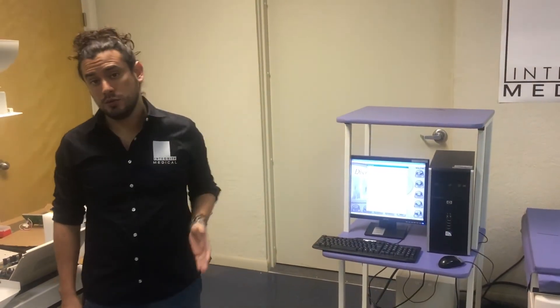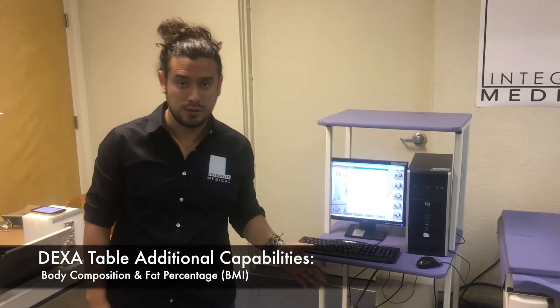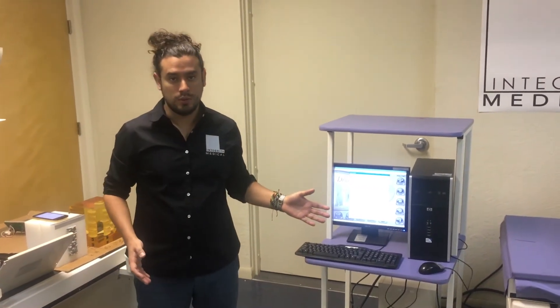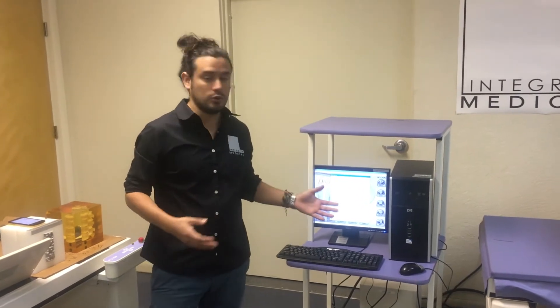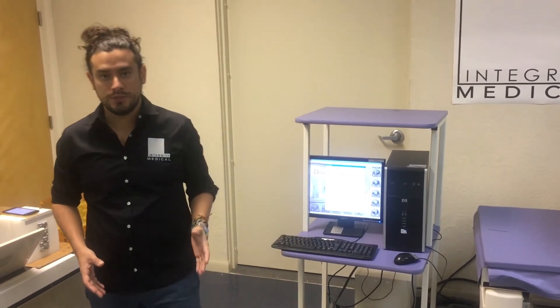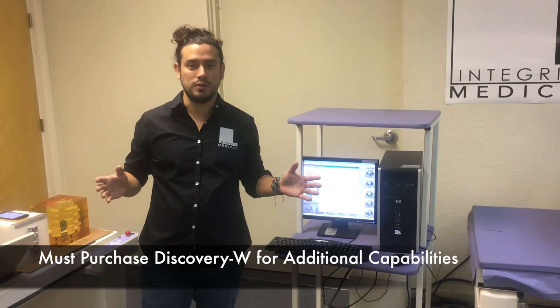A DEXA table can do more than just bone mineral density or fractures. You can also get body composition and fat percentage. In that case, you would need a different table, which will include different motors and different movements, and the results will also be different. You will get BCA and body fat percentage of different body parts. For that need, you will have to purchase something called a Discovery W.